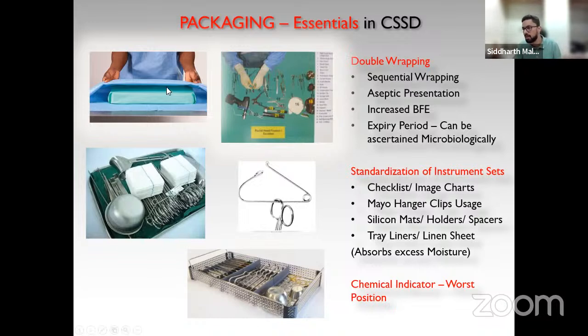This will ensure that any kind of bacteria, pathogens, which have remained on top of the covers, remain outside your OT, and only the fresh laundered linen, which has been used for packing your trays, actually comes inside near the table.